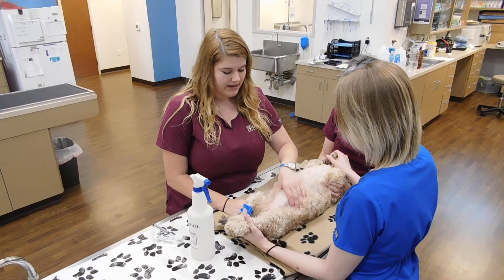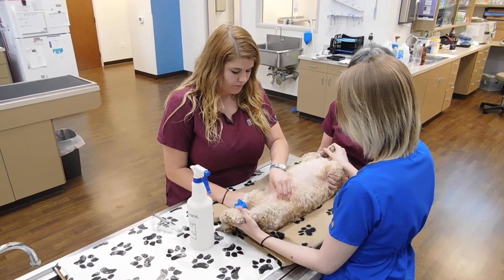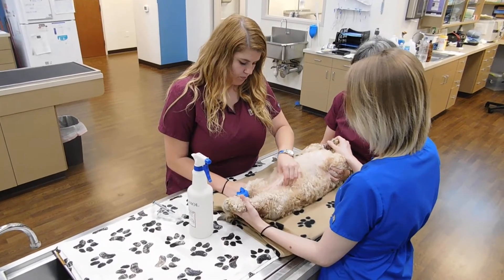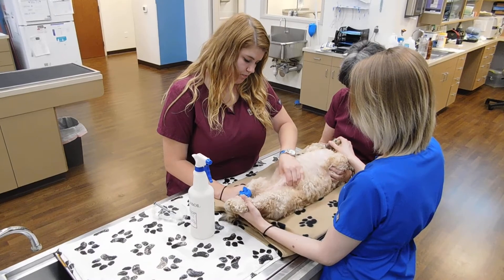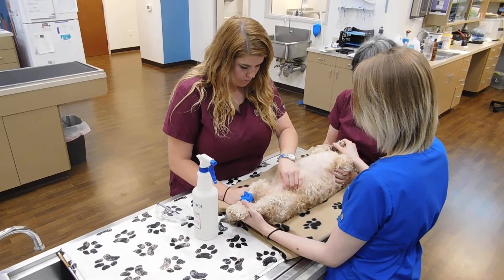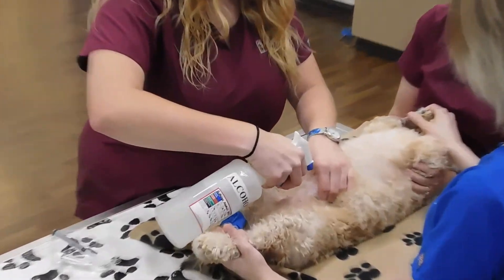Now I'm going to go ahead and palpate to find the bladder. I'm going to spray alcohol on the site.